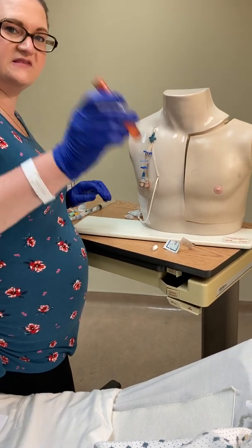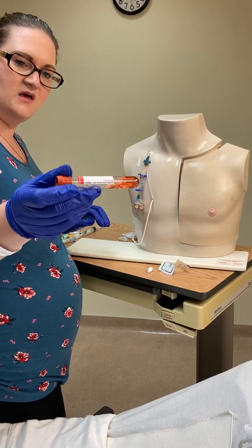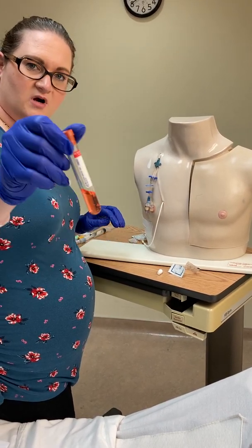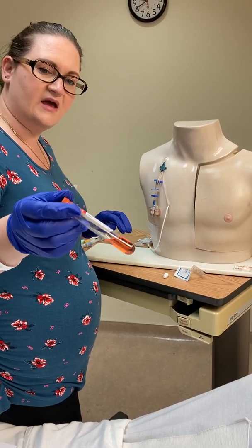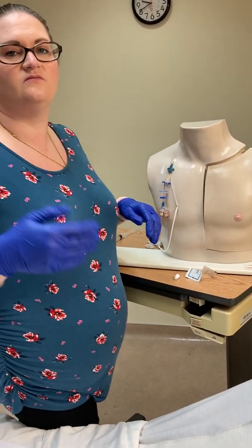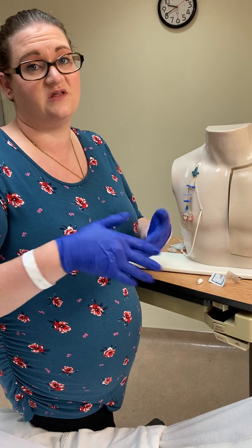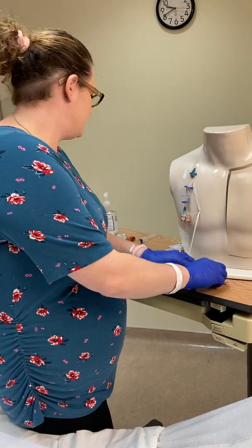Place the patient's label on the tube along with your date, time, and initials. Follow your facility's policy — you may have paperwork to send along as well. Put the tube in a biohazard bag to send to lab. Note any special instructions, such as labs that need to be delivered on ice within 30 minutes.